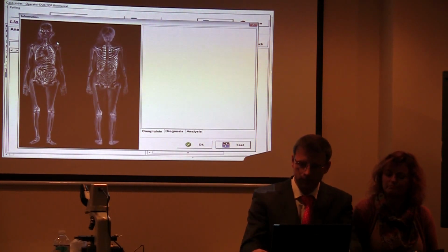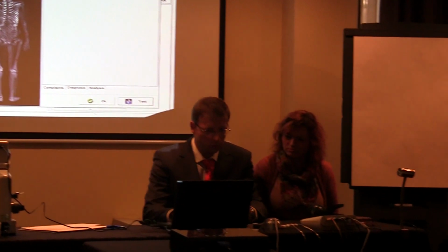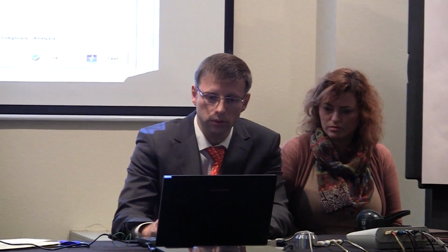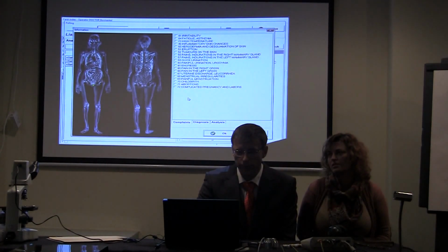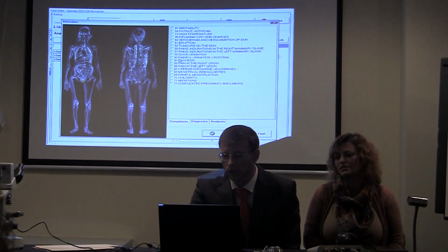Tiredness. A bit of stress. Not too much. What do you mean stress? Like when you have too many things to do, then you get more nervous, agitated, you know, anxiety. Have a look, please. We can move the point to the correct area of pain if we have it, and what kind of problem? It's painful, like a frequent pain, yeah.